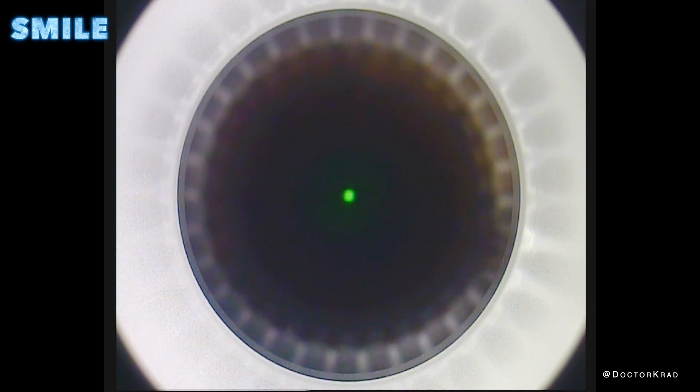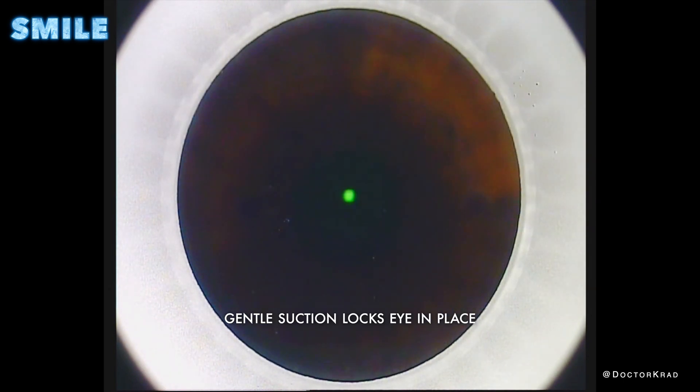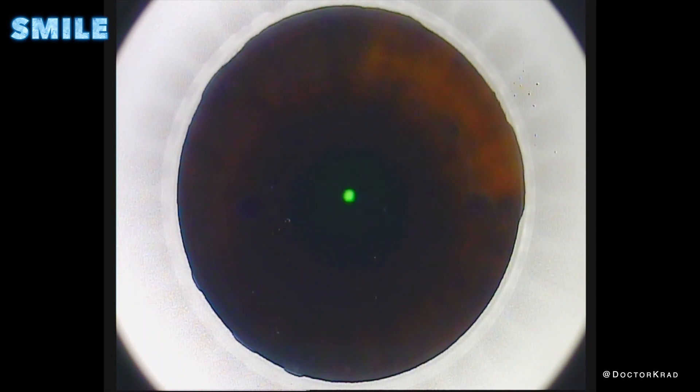Hey guys, it's Dr. Cradd here, and today I will be showing you a video of smile surgery. Smile surgery is a type of surgery to help get rid of glasses or contacts for people who are nearsighted with or without astigmatism. The patient is asked to look at this green blinking light, and they can see it the whole time throughout the procedure.